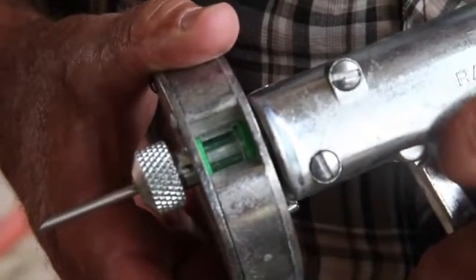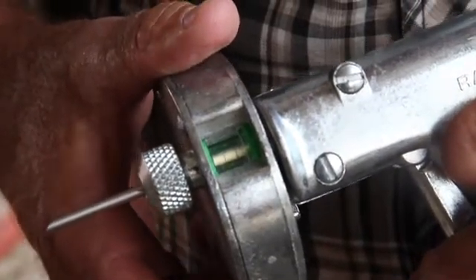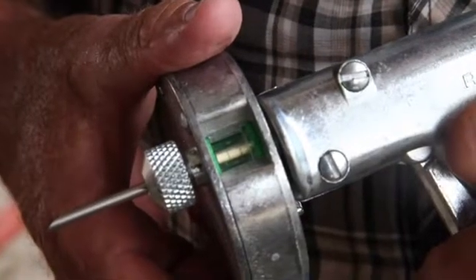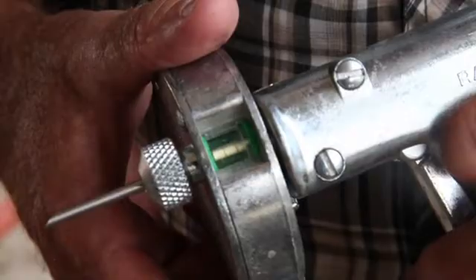Rotate the cartridge in the direction of the arrow on the back of the Rall-O-Gun until a new dose is visible and centered in the window. The Rall-O-Gun is now ready to deliver the next implant dose.